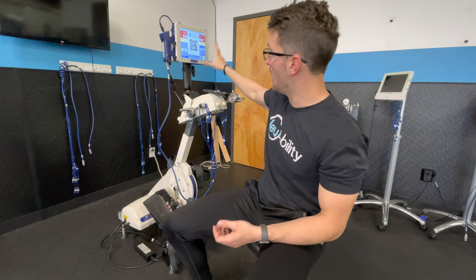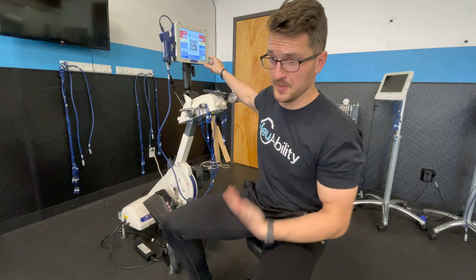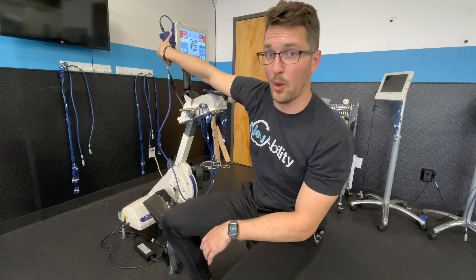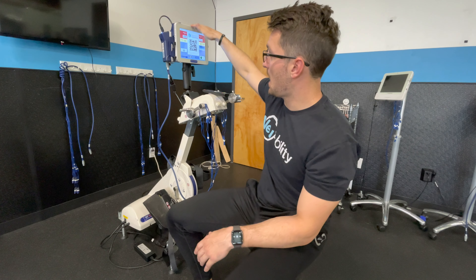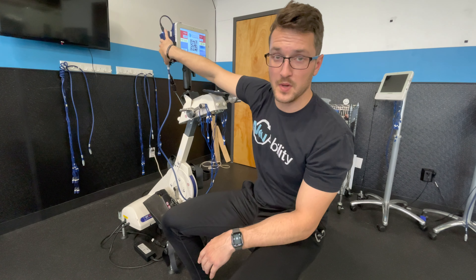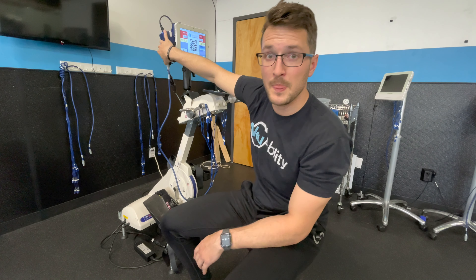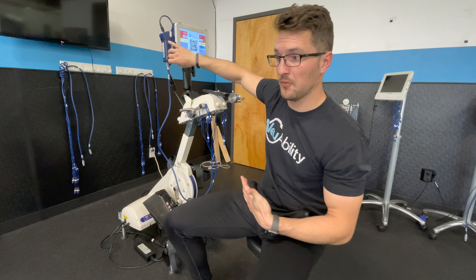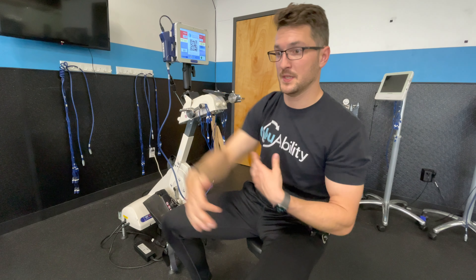Up top there are two main components. This tablet here is essentially the computer — the brains — and this box here is called the ergometer, which provides the power. The ergometer basically allows for work to be done and measured.